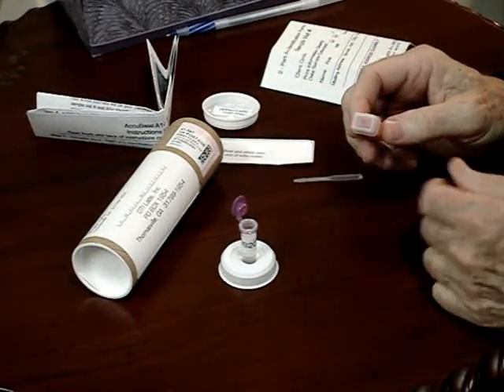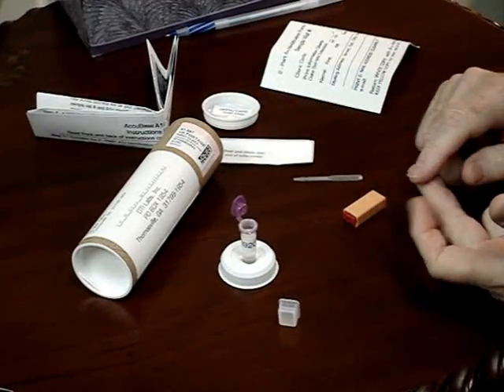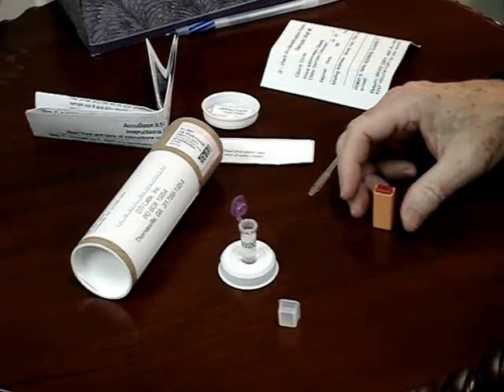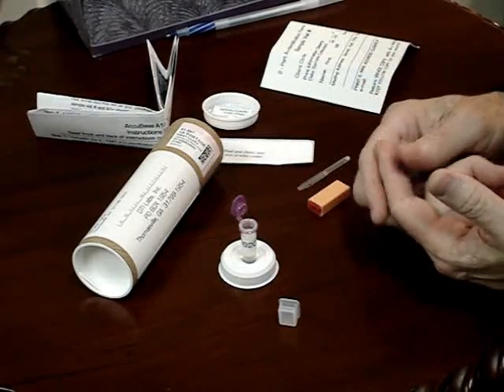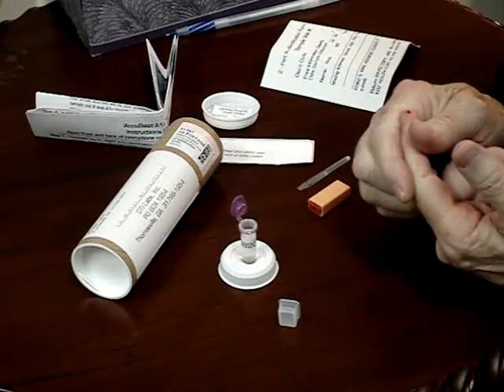Next, remove the cap from the single-use lancet. Select the puncture site on the side of your finger. Press it firmly against the red portion of the lancet. Next, squeeze a moderate-sized drop of blood from the finger.